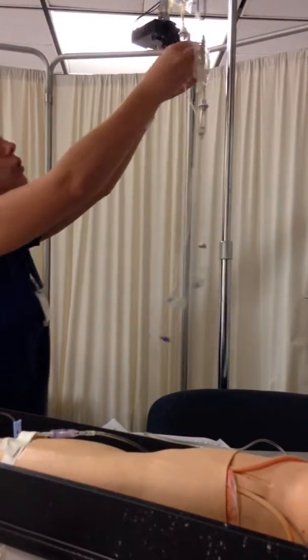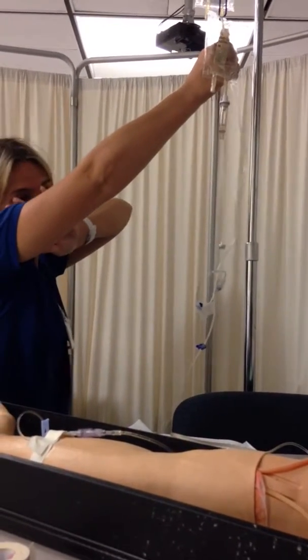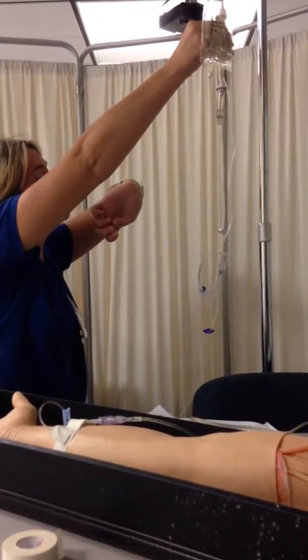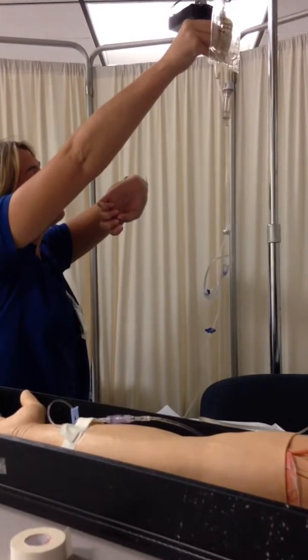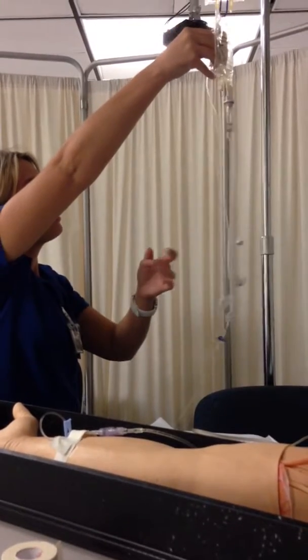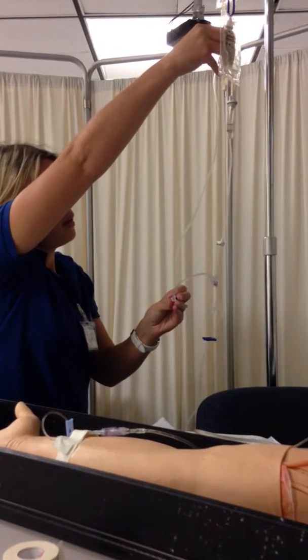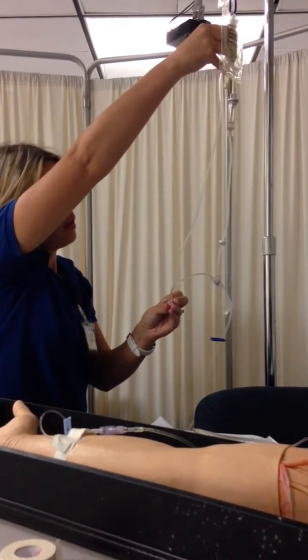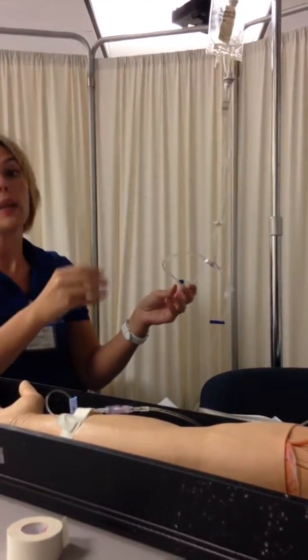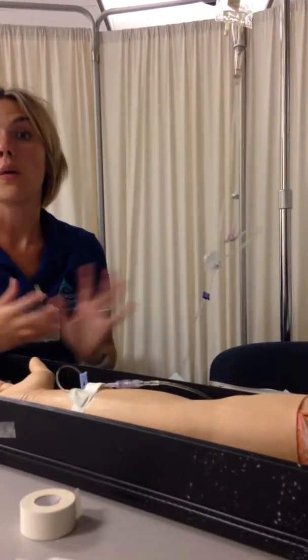I'm going to look at my watch while I get my 17 drops per minute for my medication, the dosage. I'm going to count while I'm rolling my clamp. And now I have 17 drops per minute with my clamp. And because it is higher and it's at a higher port, it's going to flow in faster.